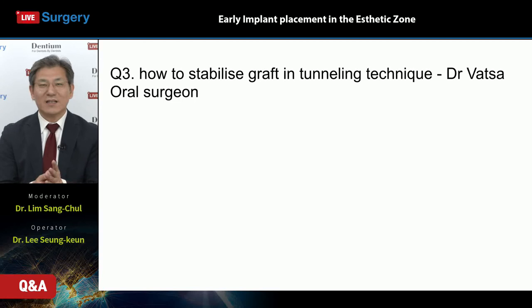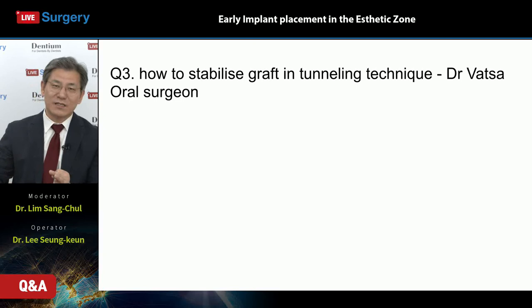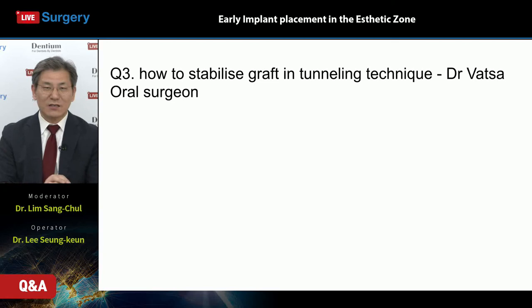Number one, the envelope is better when we have lateral augmentation. Number two, graft material selection, a hybrid type like Osteon 3 Collagen, right? It is automatically held inside of the envelope, so Dr. Lee doesn't need any additional holding suture. Just leave it in the envelope site. Make a vertical incision, make a space, put the grafting material inside the envelope, then suture and leave it. That is enough procedure for lateral augmentation, right?